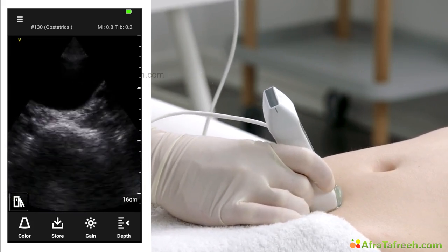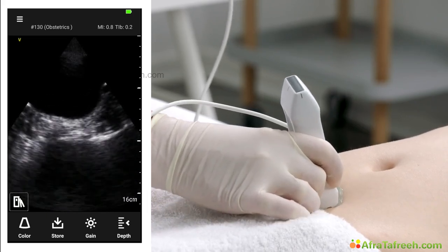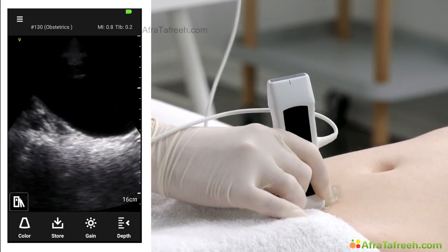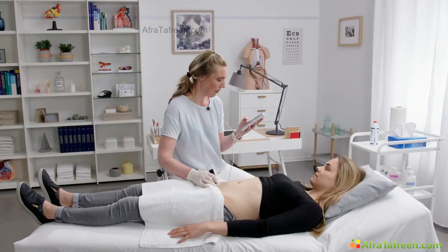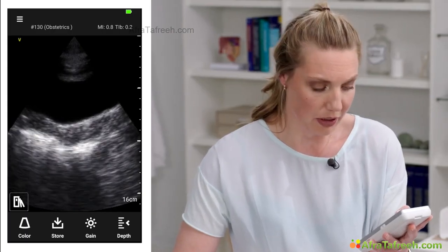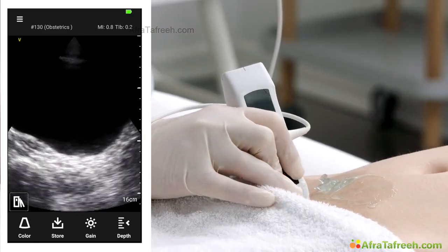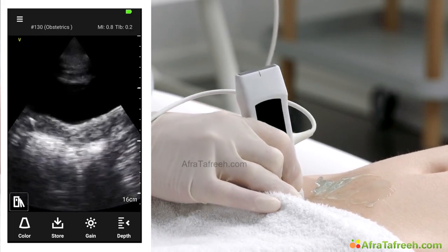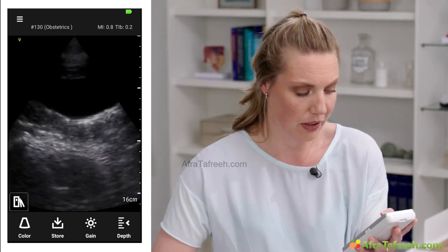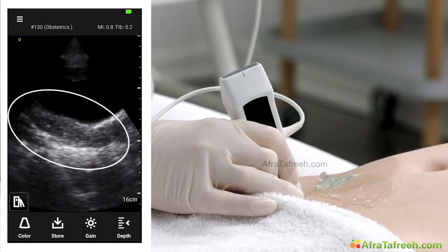If we look all the way up, we know now where to find the uterus, so we can rotate the transducer 90 degrees to a longitudinal plane or a sagittal plane. Again, we're tilting the transducer, but now on a horizontal axis, from the left side of the woman to the right side, so that we're sure that we've seen the full uterus. This is important.